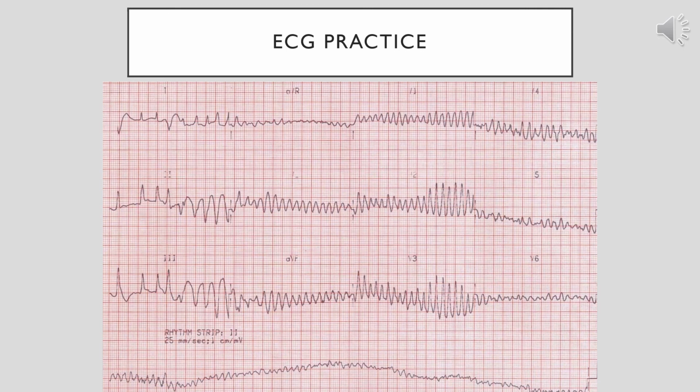Differentiating this measure, we're going to diagnose this as VFib versus AFib. In AFib, sometimes you'll still have ventricular complexes that pop up. This is a definite VFib though, where there's no discernible complexes looking at the rhythm strip on the bottom.